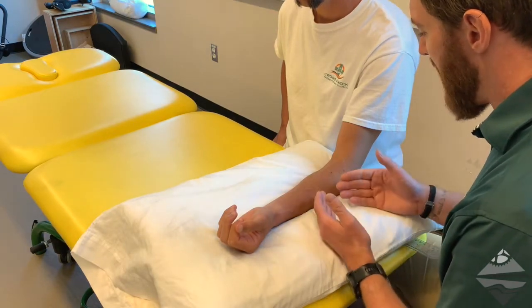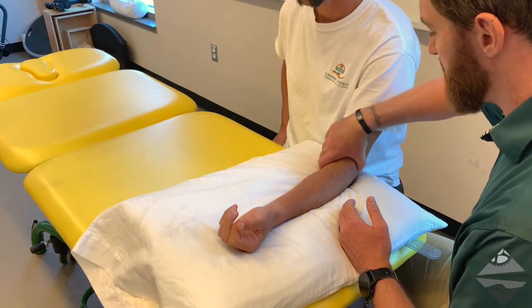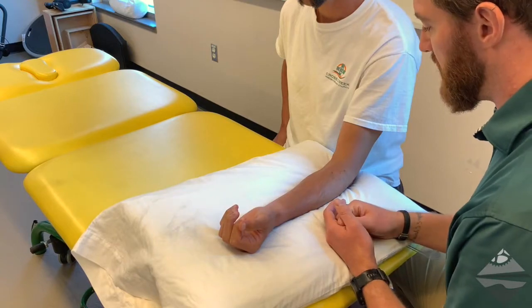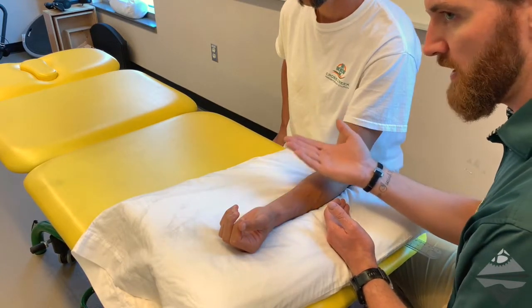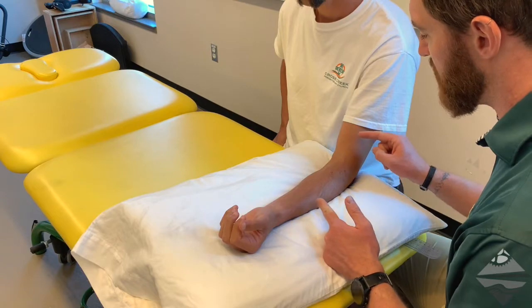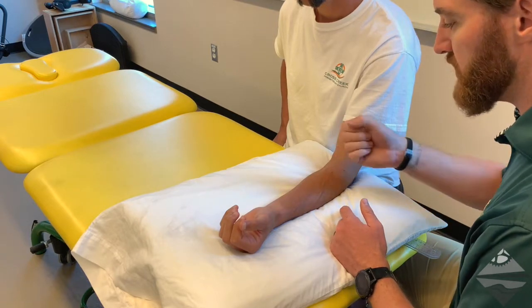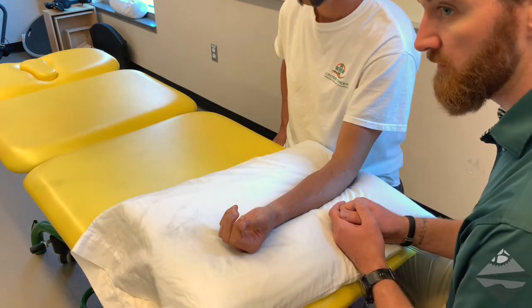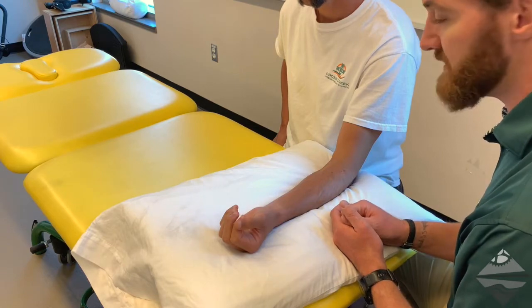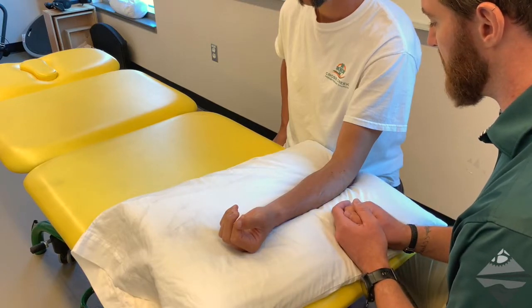While we are going through our range of motion assessment, we need to be able to identify the joint line. Recognize that the elbow is essentially a hinge joint, so there's pretty much just straight flexion and extension, with a little bit of play in varus and valgus. Because we also have the radial-ulnar joint, we have pronation and supination as well. So there are actually four measurements for active range of motion, as well as a fifth measurement known as the carrying angle of the elbow.